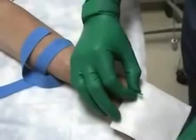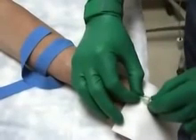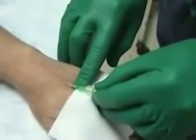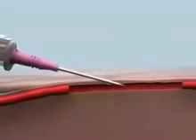If this occurs, hold the cannula hub in place, remove the tourniquet, and connect the intravenous tubing to the cannula. Running fluid into the vein may open the valve and allow the cannula to be completely inserted.